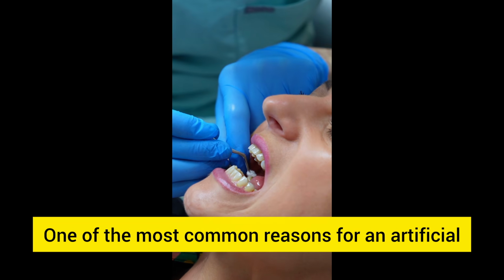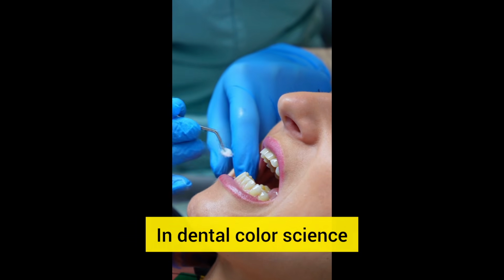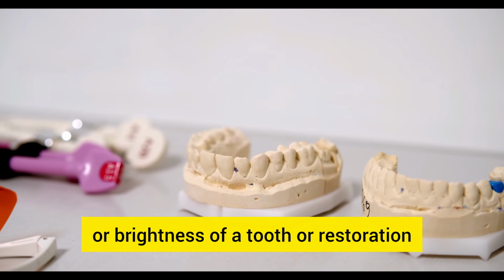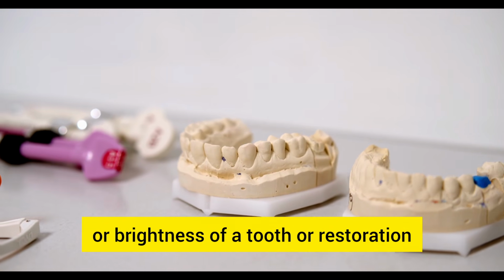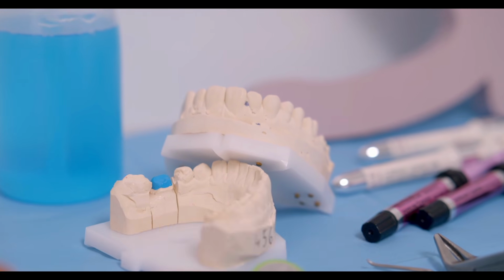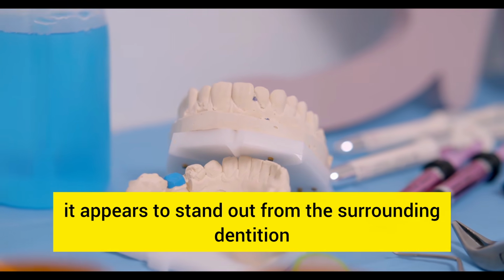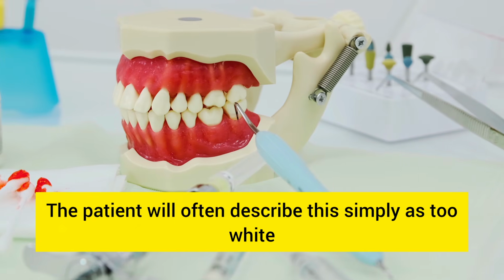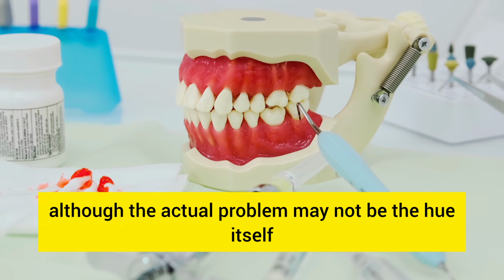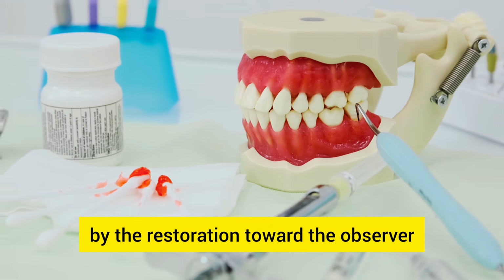One of the most common reasons for an artificial appearance is excessive value. In dental color science, value refers to the relative lightness or brightness of a tooth or restoration. A crown may belong to approximately the correct hue family, but if its value is too high, it appears to stand out from the surrounding dentition. The patient will often describe this simply as too white, although the actual problem may not be the hue itself, but rather the amount of light reflected by the restoration toward the observer.